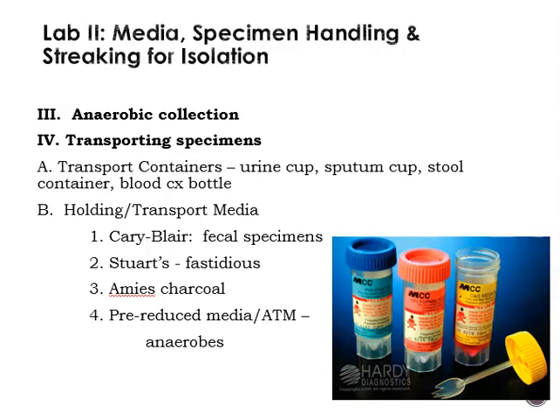So if the doctor suspects an anaerobic organism, meaning one that does not grow in the presence of oxygen, then we have to receive that specimen in a collection or storage device that does not introduce oxygen to the sample. That could kill the organism if it's an anaerobic organism. And it has to be from a site where anaerobes are not considered normal flora.